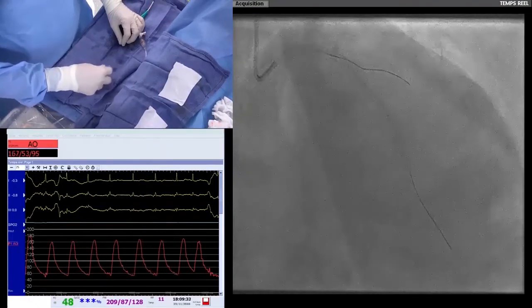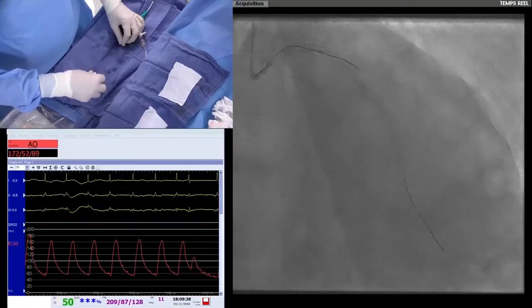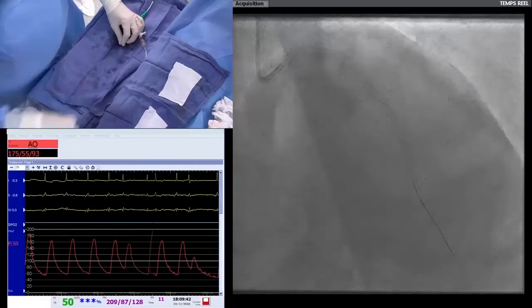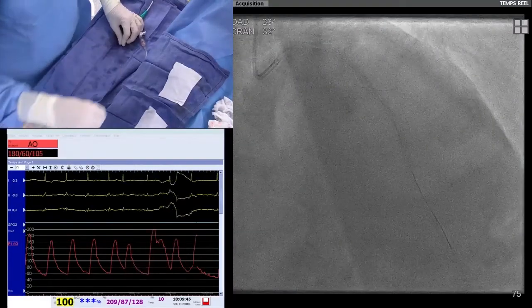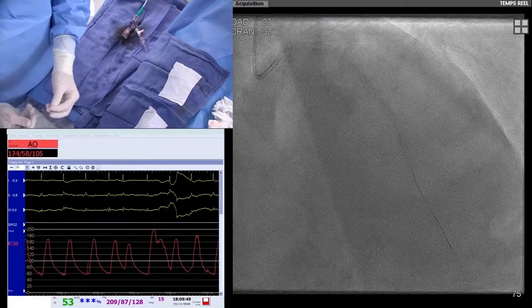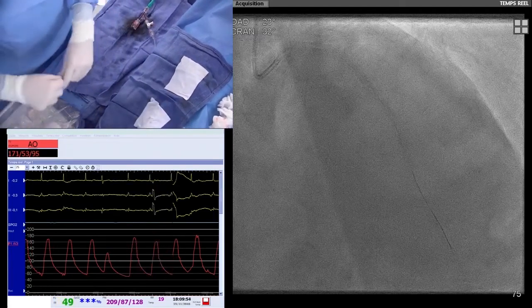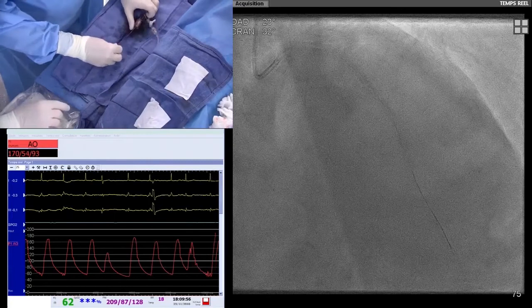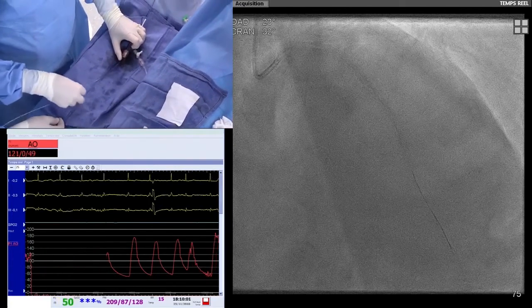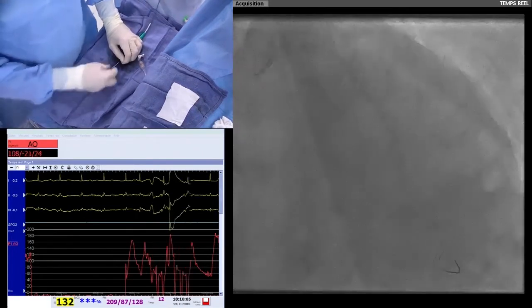So as you can see, I spin the wire just to remove it slowly, and thanks to that it avoids, I think, engaging the guiding and maybe inducing longitudinal compression in the proximal part. Now it's time to perform a proximal optimization with a 5.0 balloon in the left main, and then we have to assess the circ, and we'll discuss if we have to open it or not.